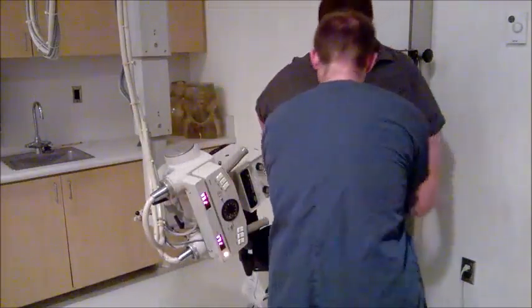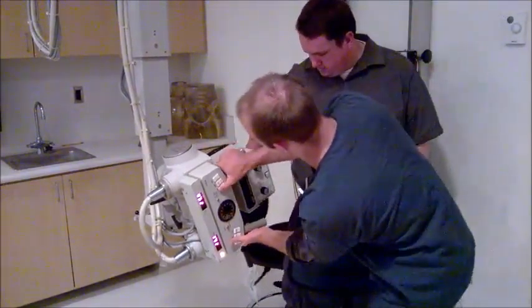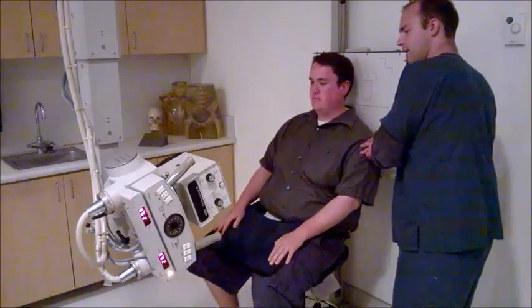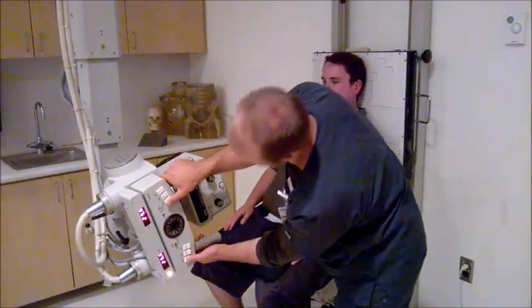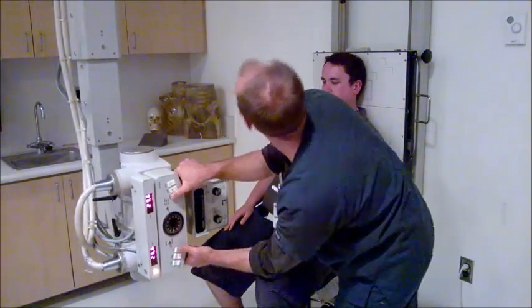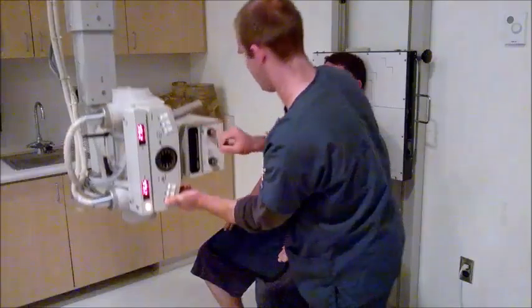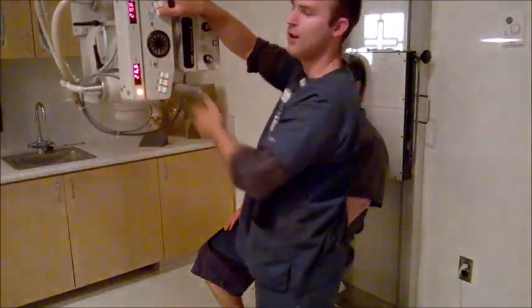All right, put this in front of you. There we go. Good, good, sir. I'm going to bring this away so you have a little bit more room. Now you can put the back of your head on the IR right here, or the board right here. Just lean back if you can. Get nice and comfy. Now it's, let's see, detented to 40. See? There we go. And now, it's an exaggerated Towns.